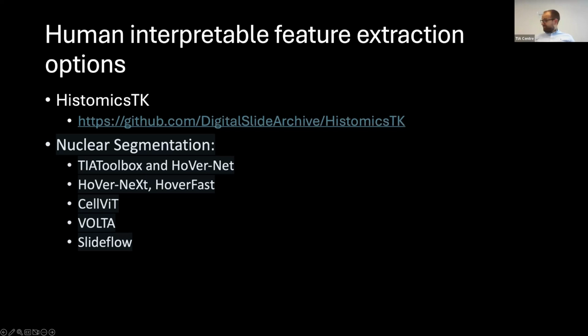The good thing with nuclear segmentation is that it's common in all cancer types, but as soon as you go to other histology primitives like glands or perhaps tumor types, it varies significantly from one cancer to another. So do you have any comment? Are you aware of any tool to be able to give us this kind of segmentation of those objects? And do you think it's even possible to do that?